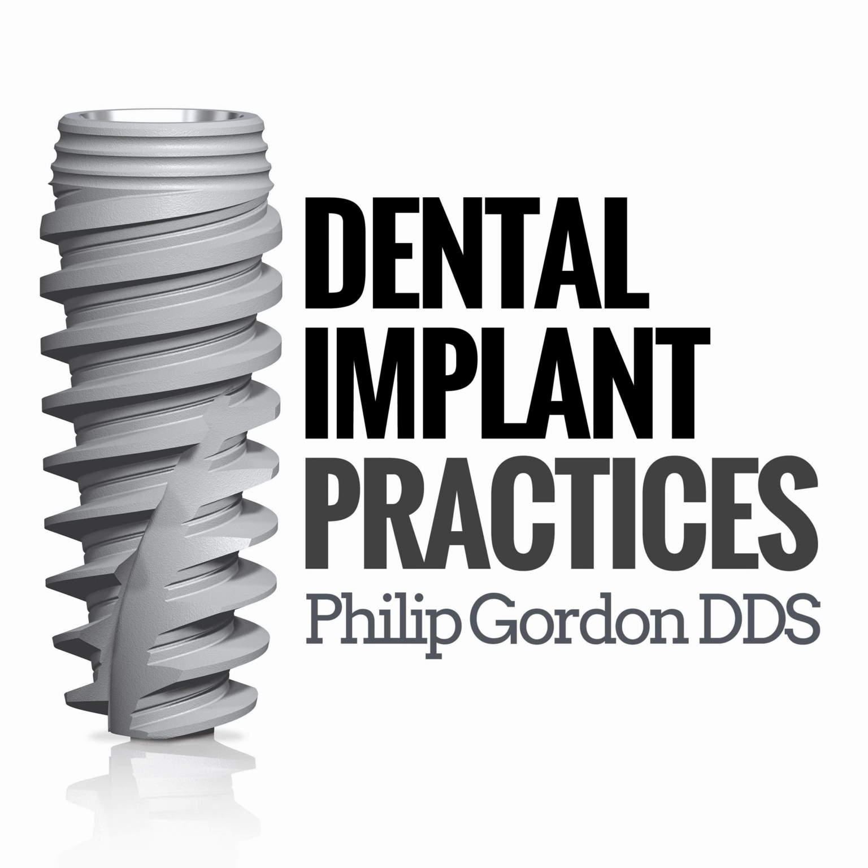Now, as far as how you get the planning data into the cone beam, it can either be done with a scanning template that has some type of radio-opaque pontic in it, or these days we use CAD-CAM technology where we're actually importing the CAD-CAM image into the cone beam image and using that for planning and actually for designing the surgical guide. And in many cases now, the guide can be printed from a 3D printer with complete digital workflow. And so it's really changed the game.